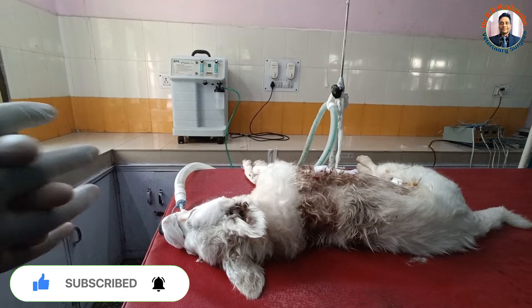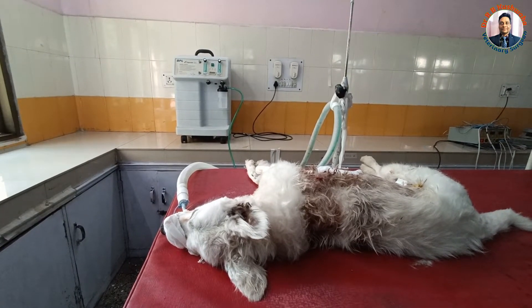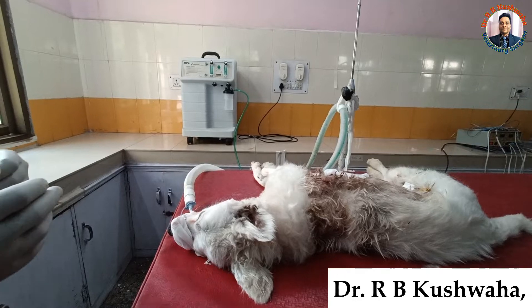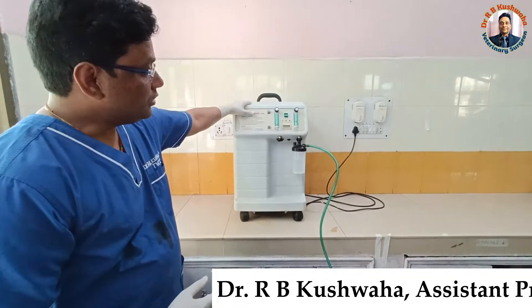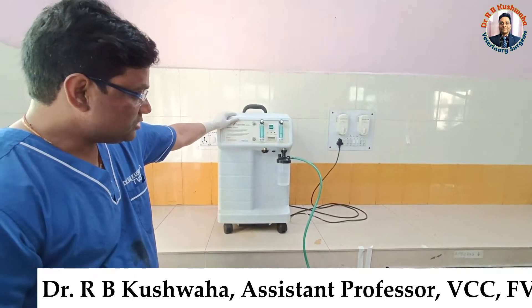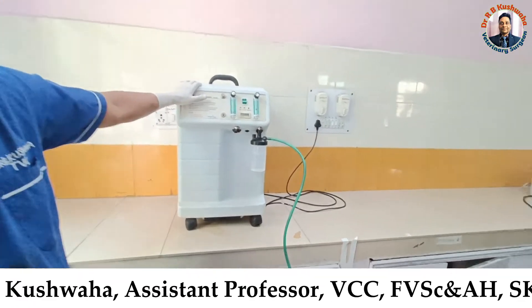Today I am going to demonstrate how to utilize the oxygenator for the animal for providing oxygen during anesthesia. You need only two things. One is the oxygenator. This oxygenator, during the COVID-19 pandemic, saved the lives of a lot of human patients. It is very effective for humans, but we can also utilize it for animals as well.